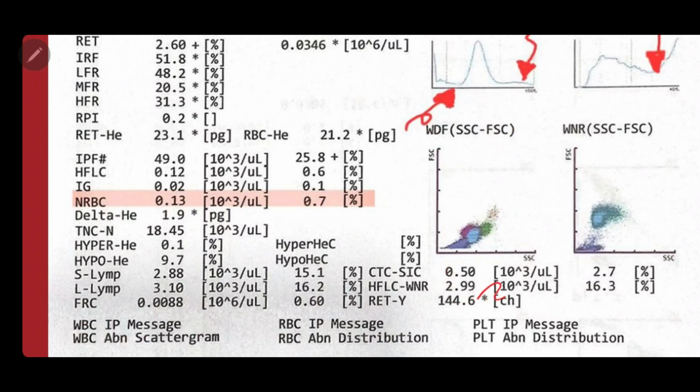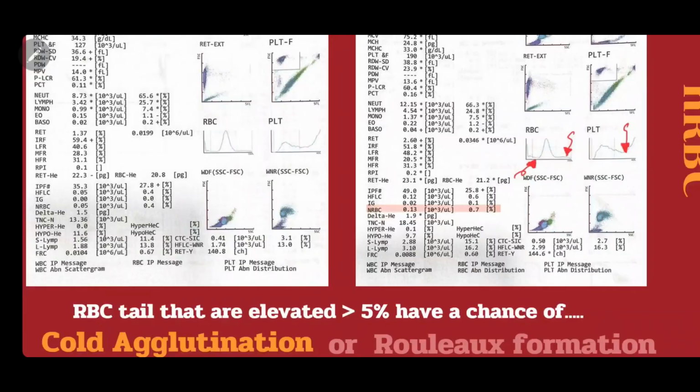If we look closely, we can see that RetY is starting to decrease, indicating that iron deficiency is beginning. From this point, let's move on to the next day, but quickly.